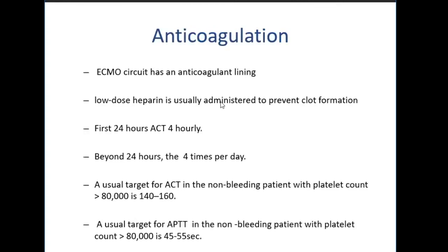It is not possible to support an ECMO without anticoagulation; there is a high chance of thrombosis and clotting. Although the recent new circuits claim to have an anticoagulation coating, and in the first 3-4 days the chances of clotting are less, the longer you keep the patient on ECMO, the higher the chance of clotting. So the ECMO circuit usually has an anticoagulation lining. A low dose of heparin is usually administered to prevent clot formation.